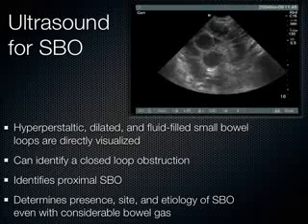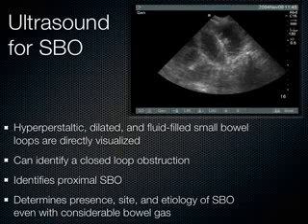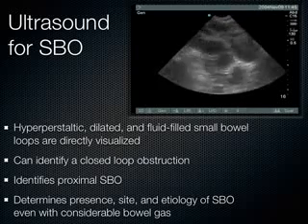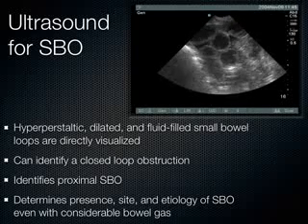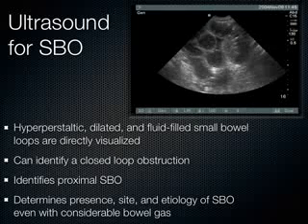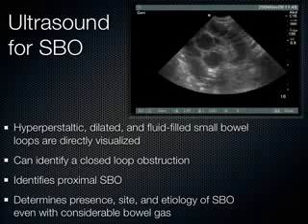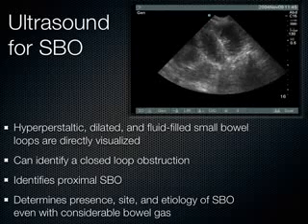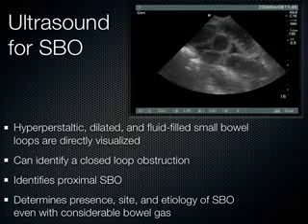So somewhere between X-ray and CT lies ultrasound with its test characteristics. And what you see with ultrasound is pretty easy to see, actually. If I've got a patient who's pretty distended, I just walk over with the ultrasound probe, they're vomiting, they've got all the clinical signs of small bowel obstruction. Well, this is what I see. I see these dilated loops here of small bowel. Notice the plicae circularis going all the way across the bowel there. The walls are usually thickened, though sometimes in an early small bowel obstruction the walls have yet to become thickened.